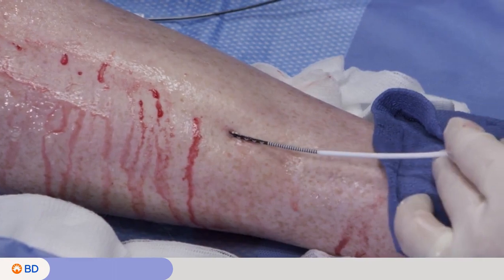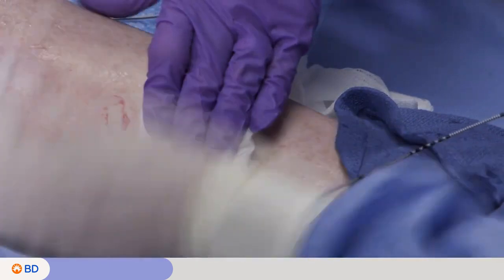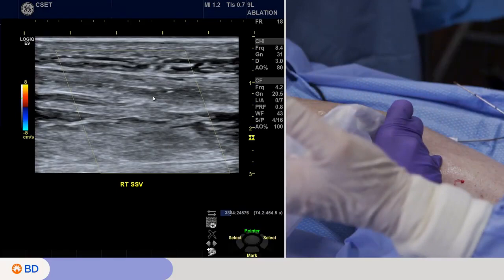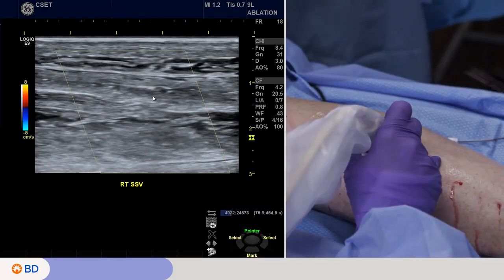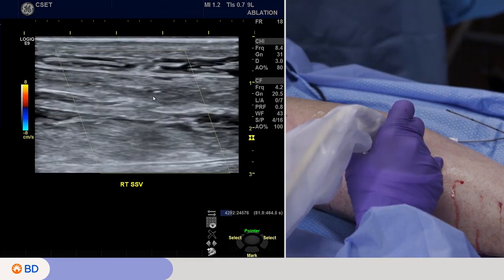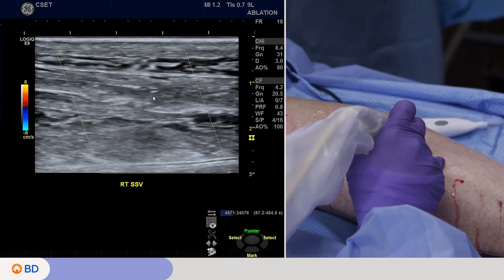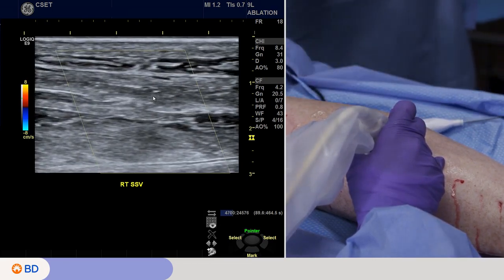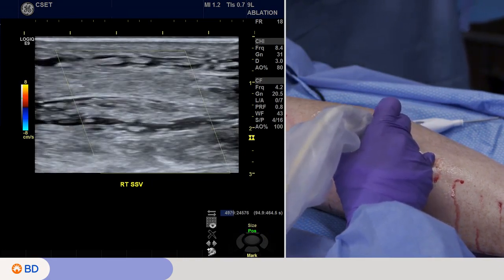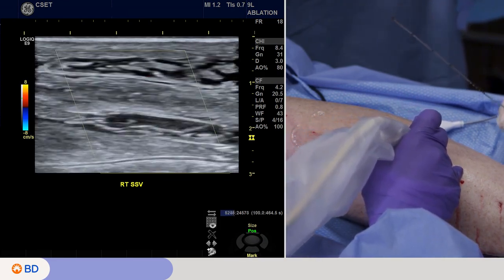So I'm going to take this out and simply put pressure on the entrance site, and we're done. So the color is on right now. If we had patency of the vein, we would see a little ribbon of flow. It's not unusual to see that, whether you're treating a great or small saphenous vein, because when we take out the device, the tool, there's a little void where the catheter was. And without a lot of pressure, you might see a little patency immediately afterwards. Don't be surprised by that.